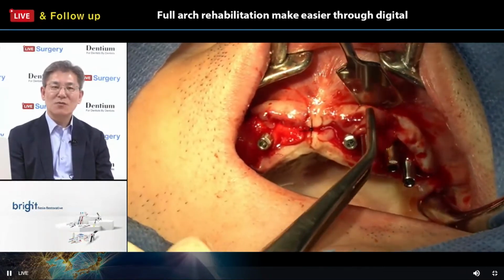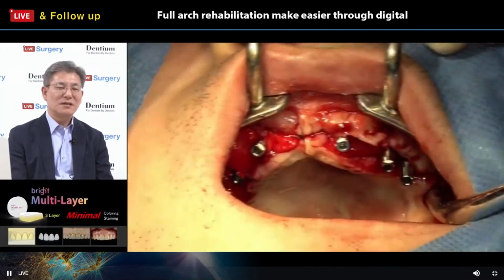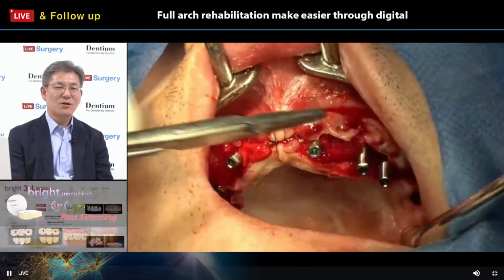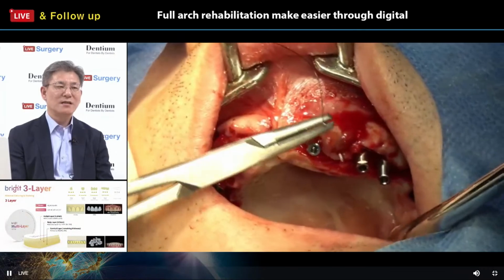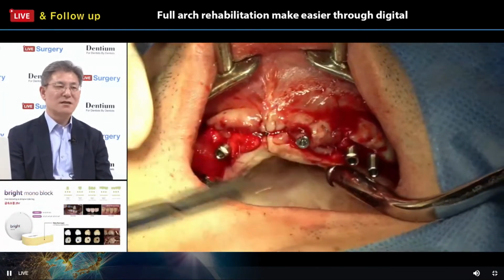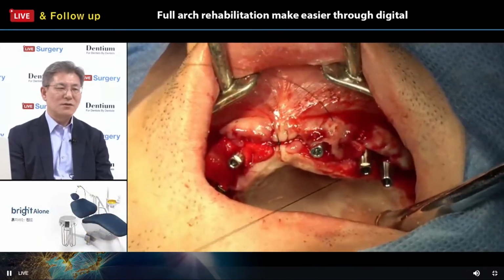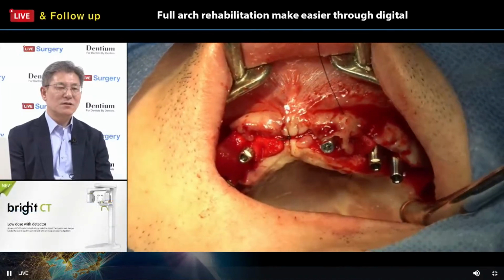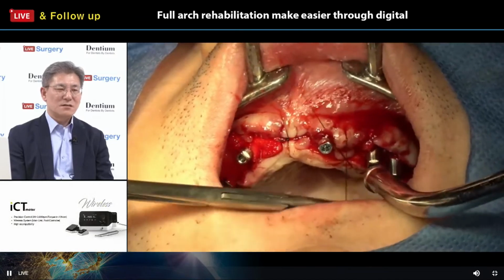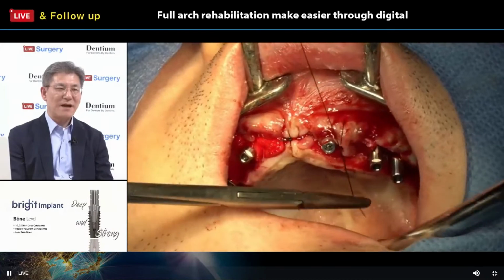It is another trauma to your patient and to the surgical field. So swelling, delayed healing, sometimes ecchymosis, and many discomforts will happen to your patient. So this kind of surgery concept aims to reduce all this discomfort after surgery.